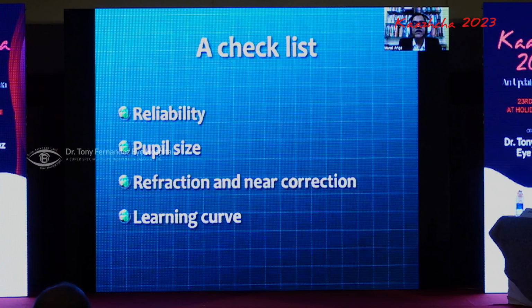You should also understand that there's a learning curve, and patients doing these tests for the first time, sitting for the first time, will not be able to understand the finer nuances. So give them some time, and always look at the first test as a trial test. Use the second and the third field as a baseline for subsequent comparisons.